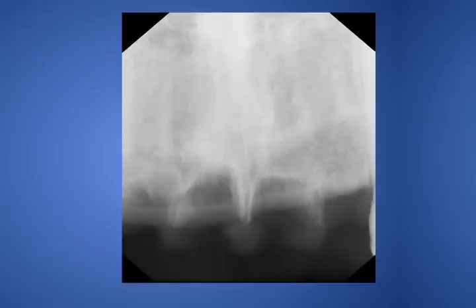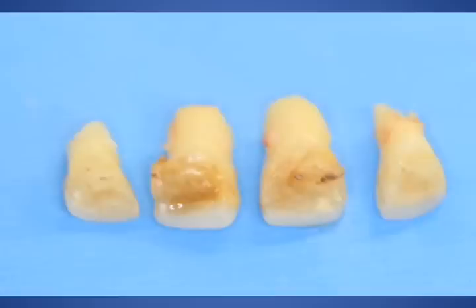Here the radiograph illustrates the extraction sockets, and again you can see that they are relatively shallow and they will be obliterated in the final osteotomies. The septal bone is maintained in this situation. It's critical that we maintain that septal bone so that we can maintain tissue height and keep the nice interdental triangles as possible. Here we see the 4 roots that were removed, had been internally or externally resorbed.